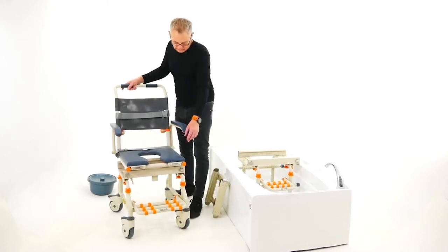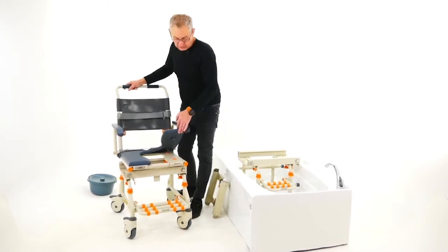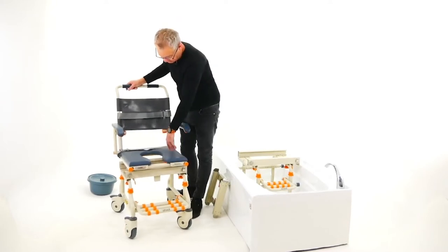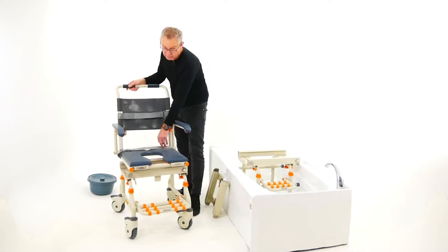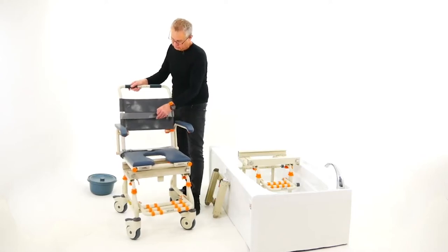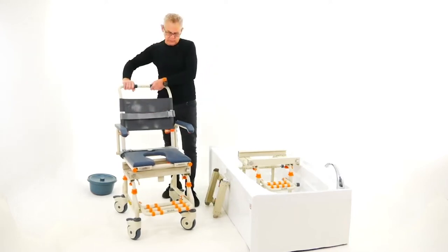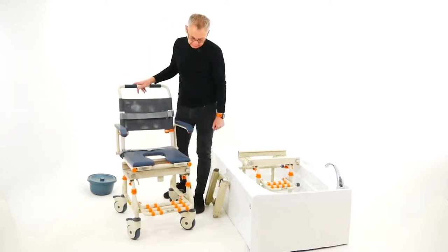The chair comes with a PU foam cushion, which people love because it's easy to remove for cleaning and just pop back down into the little lugs. It comes with lap belts, chest belts, a nice comfortable backrest in mesh which is quick-drying, soft foam arm grips, and a footrest.